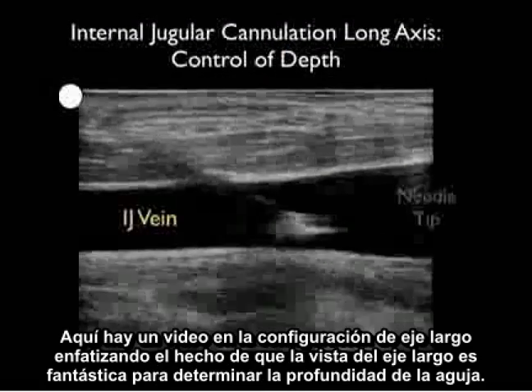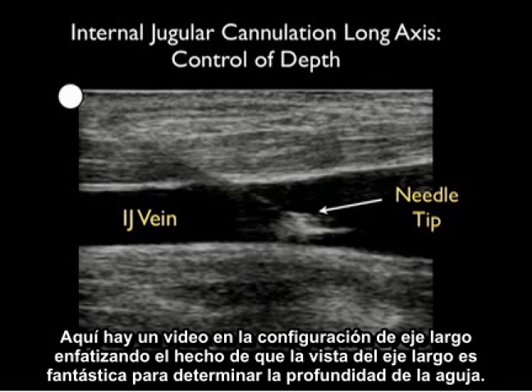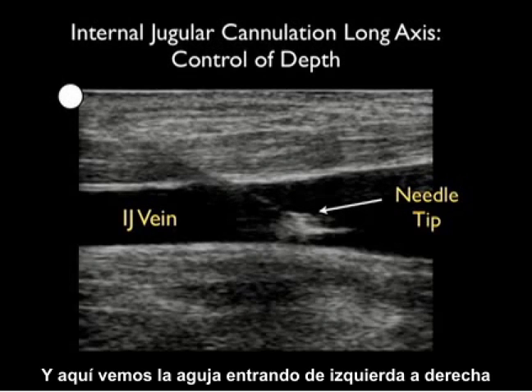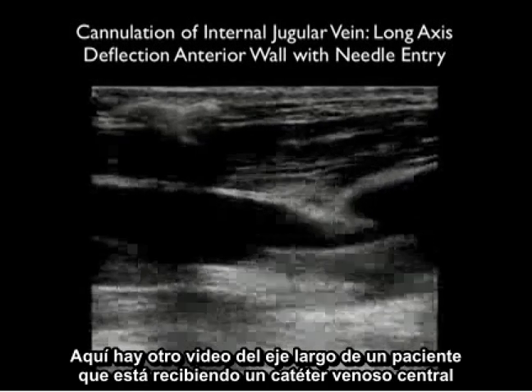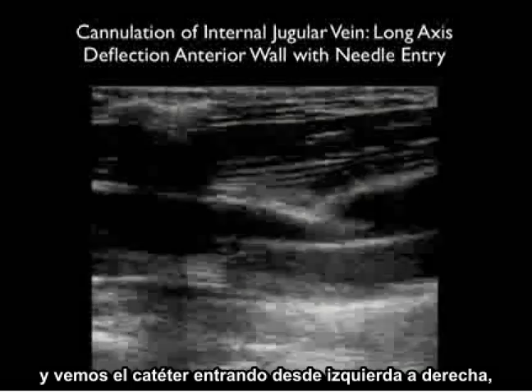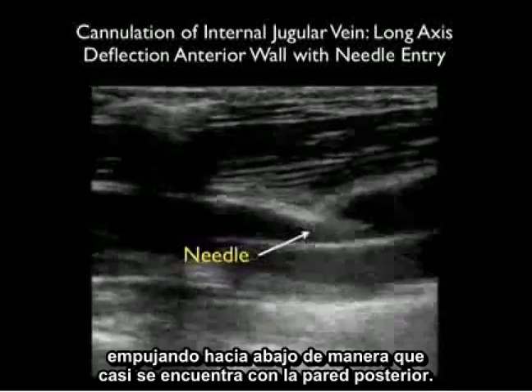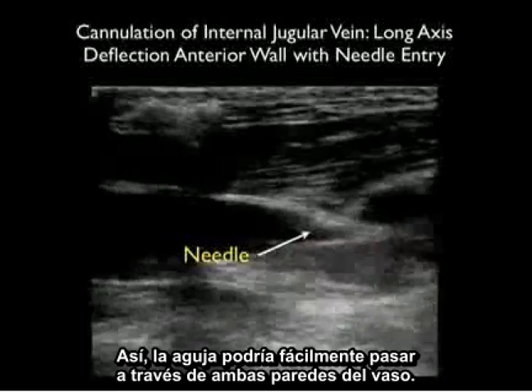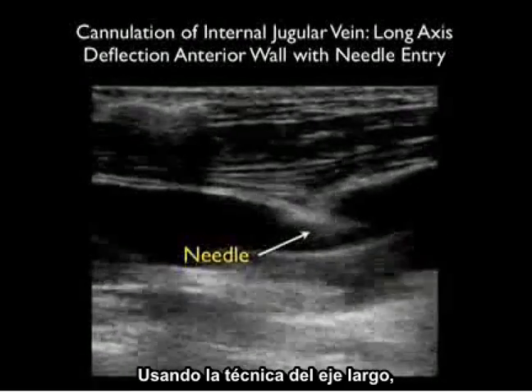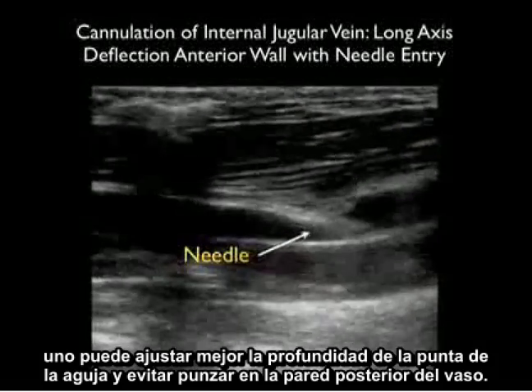Here's a video clip in the long axis configuration emphasizing that the long axis view is great for determining needle depth. We see the needle coming in from left to right and can visualize the needle tip squarely within the vessel lumen. In another long axis clip, notice how the needle tip deflects the anterior wall of the vessel pushing it down so that it almost meets the posterior wall — meaning the needle could easily pass through both walls. Using the long axis technique, one can best adjust the needle tip depth and avoid puncturing the back wall of the vessel.